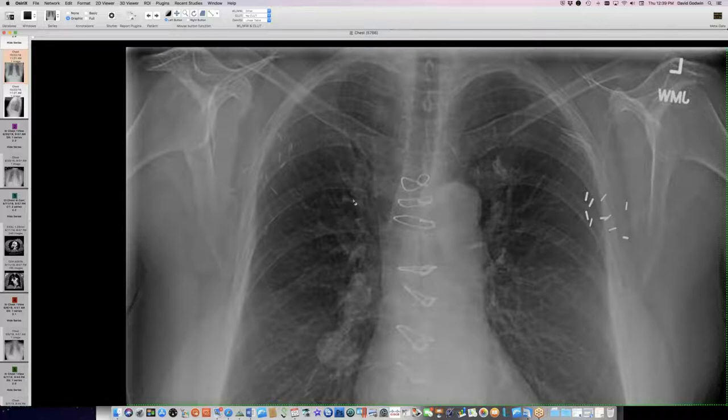Generally things look a lot simpler after a transplant because a whole lot of hardware disappears — LVADs disappear, defibrillators disappear, all these patch electrodes. Things suddenly look blissfully empty and simple because they threw away the old heart and all the gear that was attached. So it is interesting that they left that pseudoaneurysm there — maybe they'll go after it now that everything's stabilized.